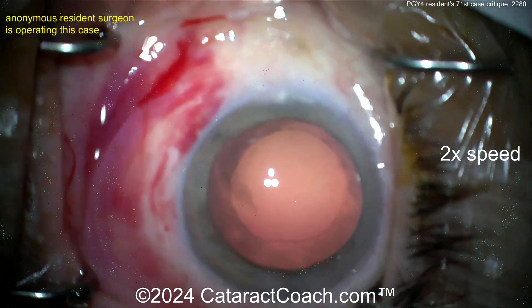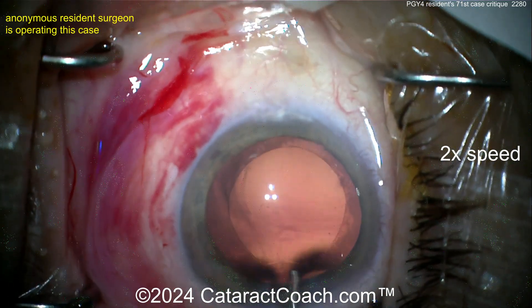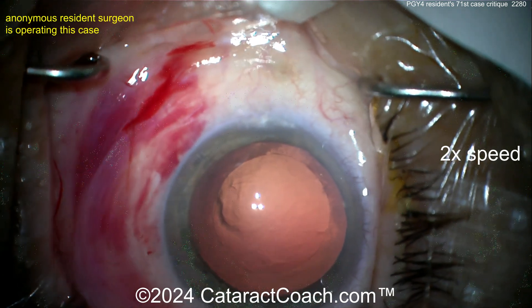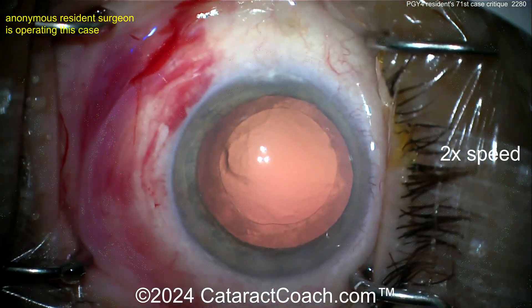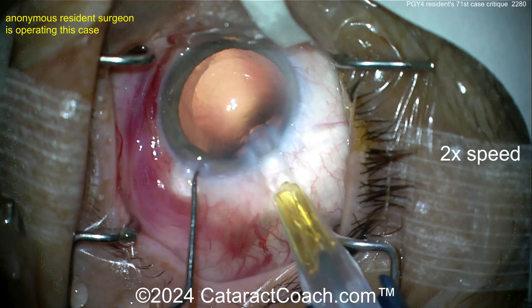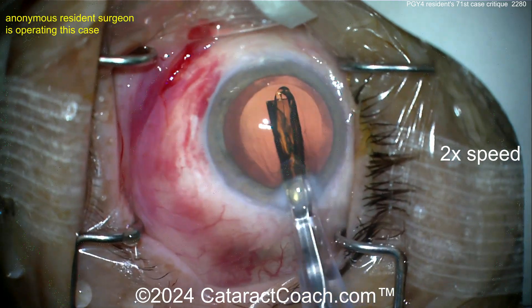Looks like a pretty generous rhexis — not the best centration but tolerable for case 71. You're doing a great job. I can tell this is less than 100 cases done, and there are incremental improvements to make. Also: why is there a subconjunctival hemorrhage? In private practice, patients will complain about that — make sure you're not causing it too often.